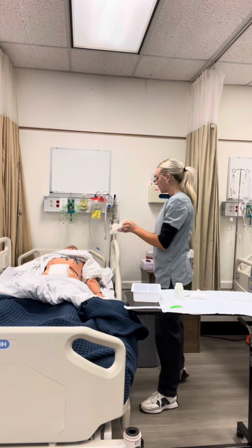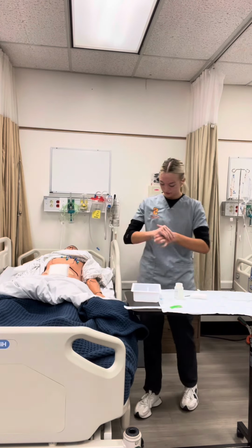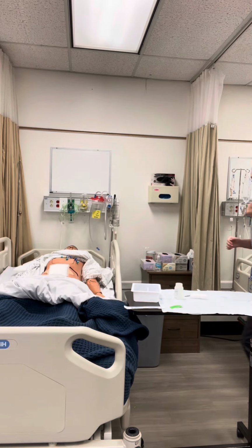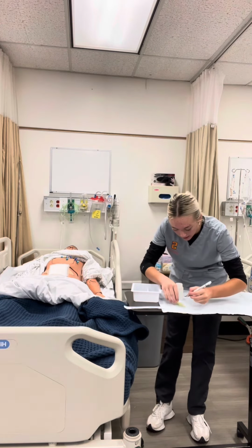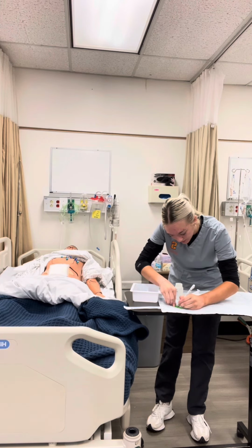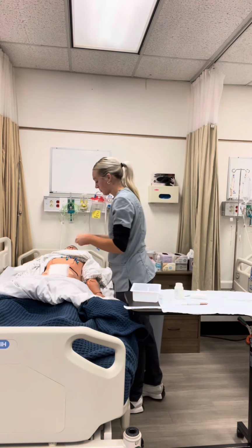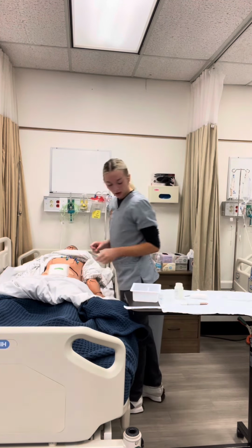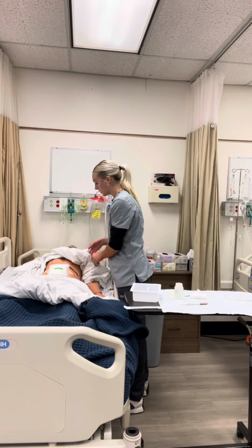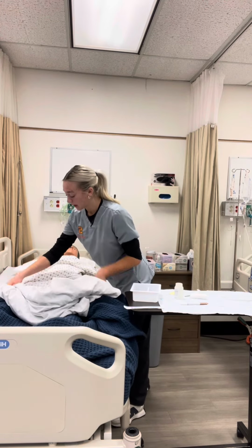So I'm going to remove my sterile gloves, perform hand hygiene, and I'm just grabbing a pen to initial and date my patient's bandage. Okay. And I'm just going to assist him into a comfortable position and assess his comfort level again.